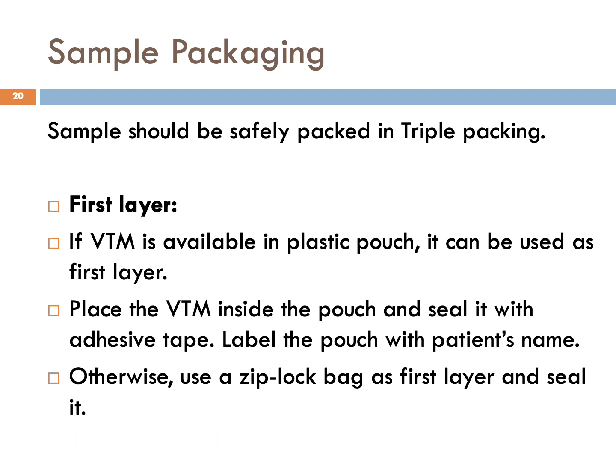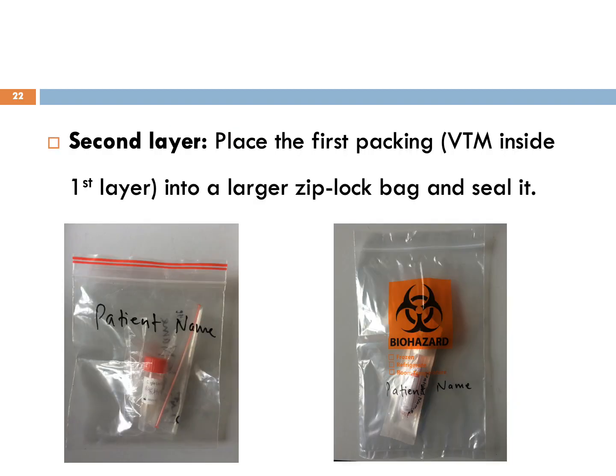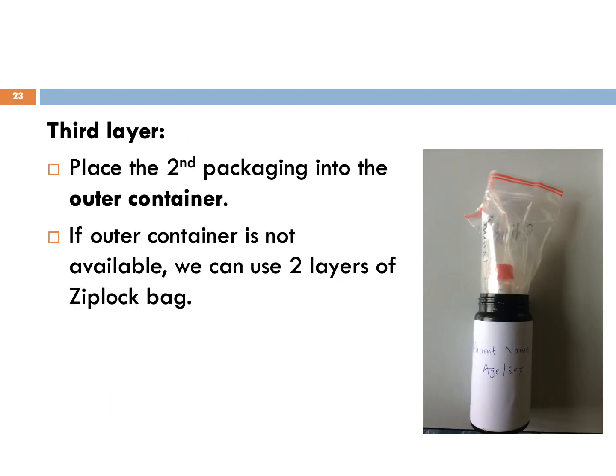Sample packaging: samples should be safely packed in a triple packaging system. If VTM is available in a plastic pouch, it can be used as the first layer — place the VTM inside the pouch and seal it with adhesive tape, then label the pouch with the patient's name. Otherwise, use a ziplock bag as the first layer and lock it. For the second layer, place the first packaging into a larger ziplock bag and seal it. For the third layer, place the second packaging into the outer container. If an outer container is not available, two layers of ziplock bag can be used.